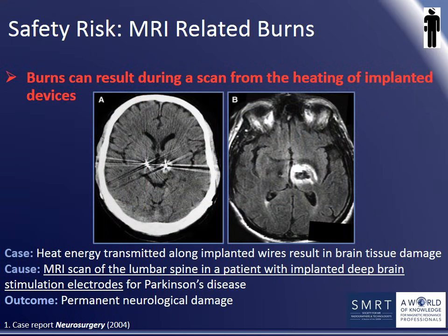This is another important reference example of a radiofrequency burn in MRI. This person was questioned prior to MRI as to whether he had any devices or implants inside of him. He had, in the past, had an implanted deep brain stimulator, but the generator box had since been removed. As far as the patient was concerned, the whole system had been removed, so he answered no to having such a device in situ and went on to MRI.